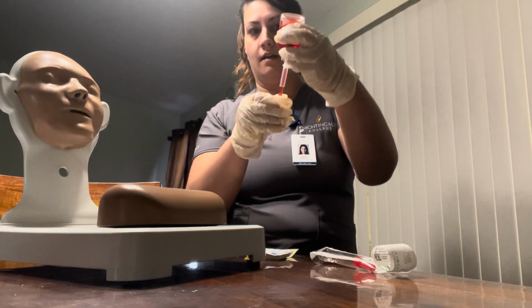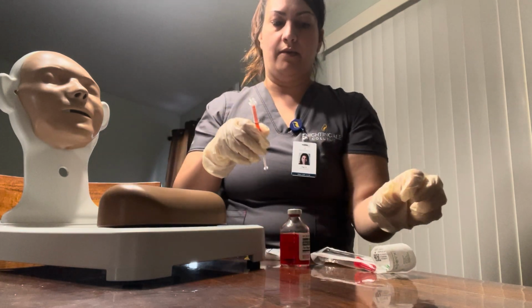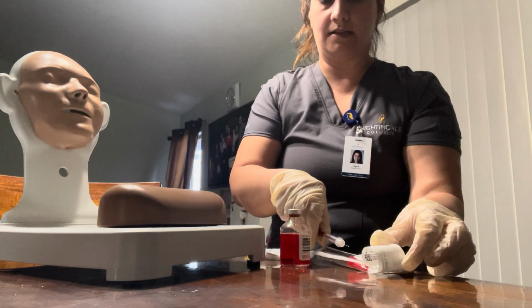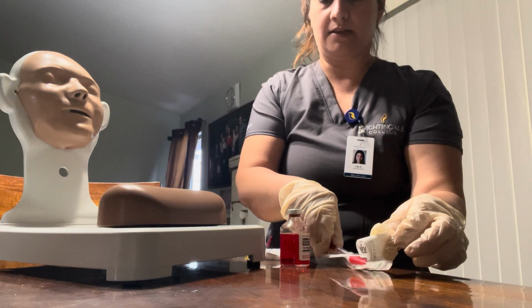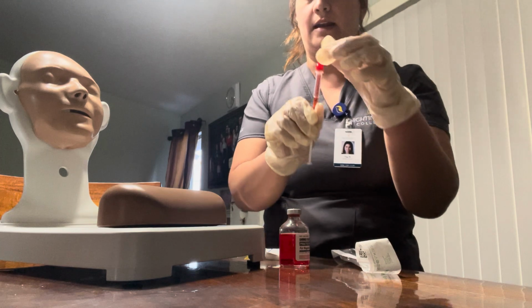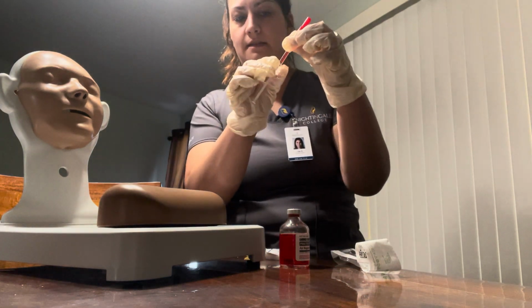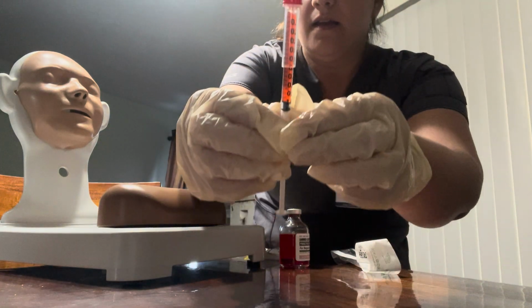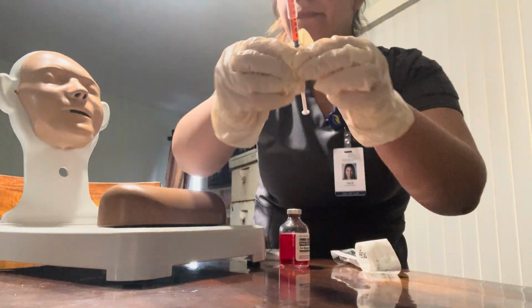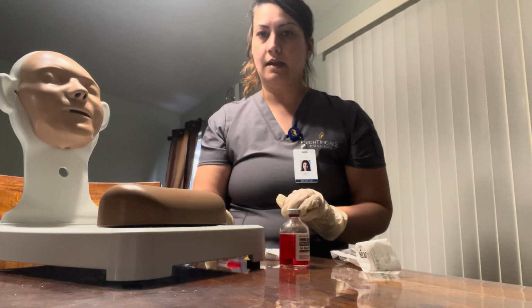I will pull out. I will cap with the one-scoop method, and I will close it. And then I'm going to show you guys, it is 1 ml. Here we go. All right, so I'm just going to set this down.